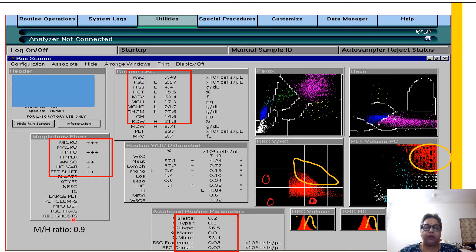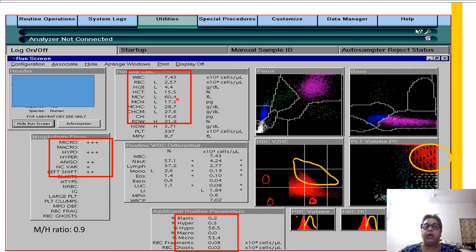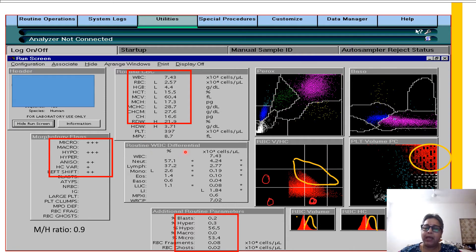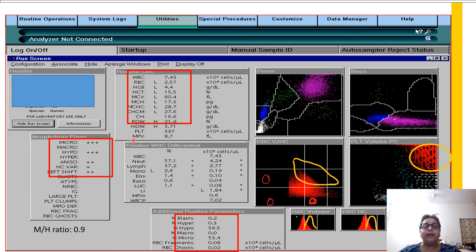You have a microcytic hypochromic ratio of 0.9. Looking at the familiar CBC values: a low RBC count of 2.57, a hemoglobin of 4.4, a low hematocrit, an MCV of 60.4, a low MCH, a low MCHC, and an RDW that is higher than normal. This fits with a microcytic hypochromic anemia that is most probably iron deficiency. So without looking at the numbers first, we looked at these pictures, arrived at a diagnosis, and confirmed iron deficiency anemia.